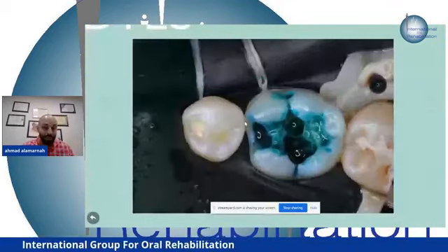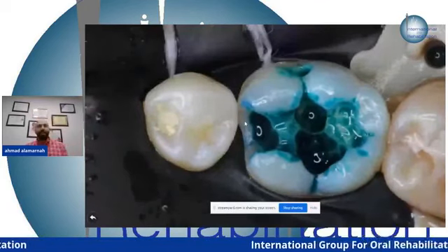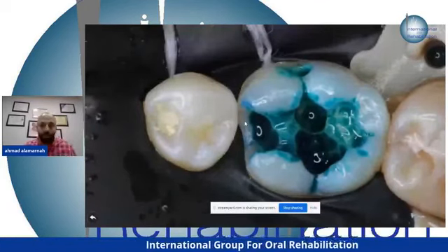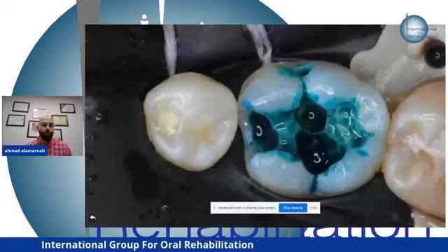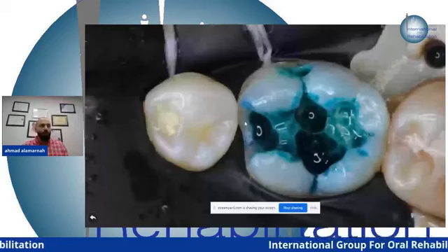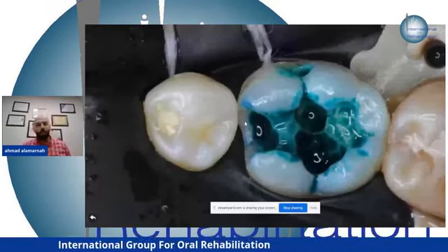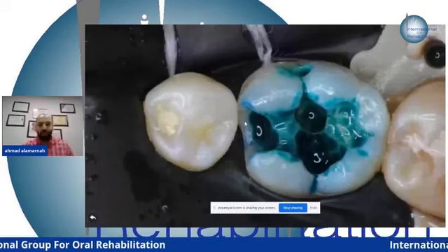And the third one that I use in my clinic is the caries indicator. The caries indicator is like the weapon that I use to kill the caries. Why? After I remove all the caries from the cavity, I see a white clean cavity.